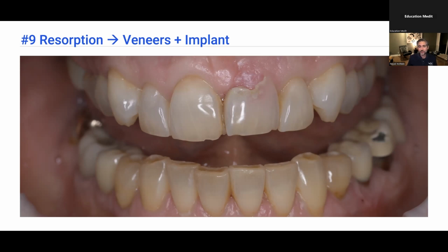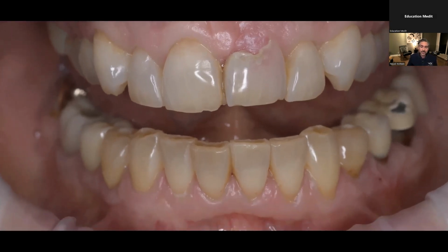And so it all starts with this pivotal moment where she needs to have number 9 addressed. And she has one major limitation, which is she understands that removable options might be necessary when she is going to have number 9 extracted, but she also is a musician and doesn't want to go without a fixed solution for a long period throughout the transitional period. So we're going to keep that in mind in our planning. And let's go ahead and take a closer look.